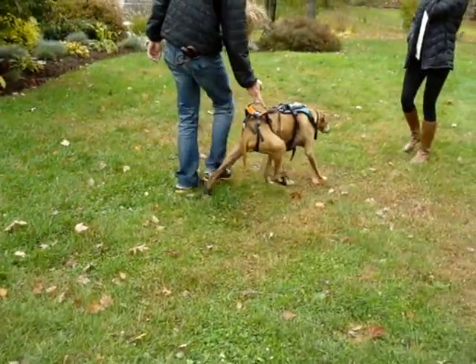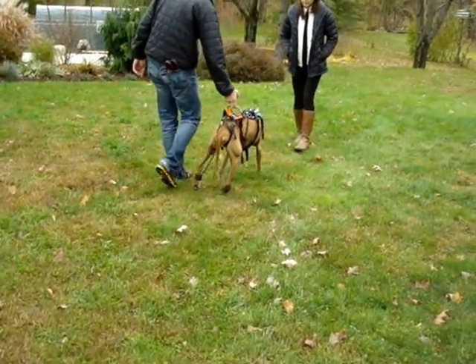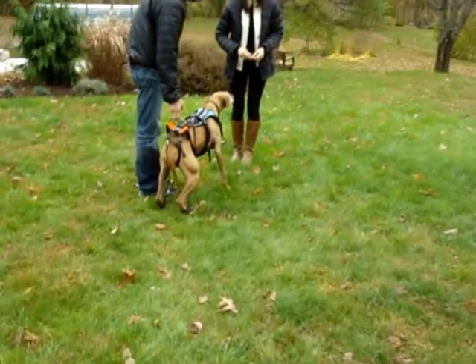The goal is to see how this system can assist her. So far in a short time — 10 minutes — we've not really seen much knuckling. She is a little weaker on the left side, so the idea would be to tighten that left side up a bit more than the right, because that's the side she's going to need more help with.